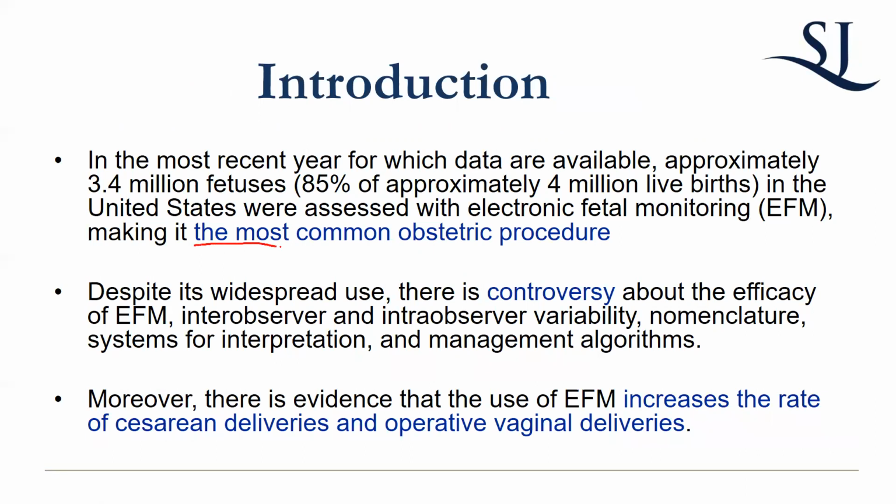your fetal heart rate monitoring can be considered the most common obstetric procedure, right? Every patient is going to have more or less continuous monitoring when they're in labor, and this also applies to your antepartum testing as well. We always have to remind ourselves that in the Northeast, it is the culture to do continuous fetal monitoring with all labor, but situations where you don't have to have it on the whole time, which is referred to as intermittent monitoring, are very much a thing and happen in other parts of the country and across the world. So there's always a policy for monitoring the fetal status, which follows these same rules. It's not always continuous. Just keep that in mind, okay?